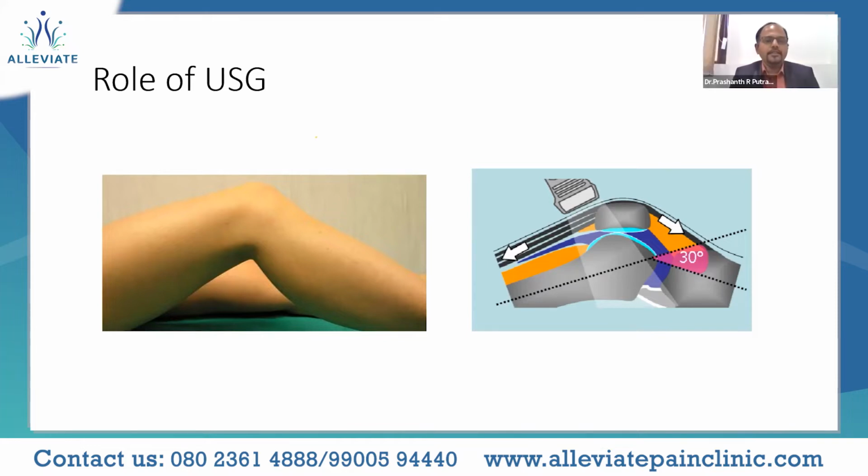So then we move ahead with the scanning of the knee. Okay. Ultrasound has revolutionized pain management, where you can do a lot of interventions, and they are very target precise because of the help of the ultrasound. All right. So we have already discussed the anatomy of the knee. So let's look into the sonoanatomy of the knee, after which it will be followed up with the sonopathology and the various applications of ultrasound in terms of any interventions on the knee.